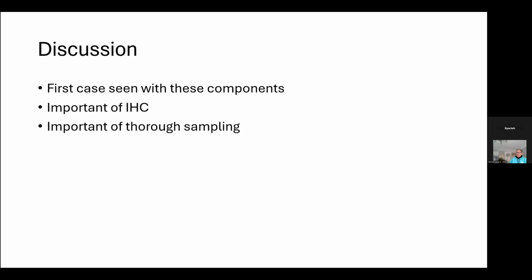the block, and then the date, and it was actually CD45 positive. And they also did the other markers, and it didn't show anything relating to lymphoma, but just mainly lymphoid cells. And so I just did an addendum report and told him that the suspicious area turned out to be just a lymphoid aggregate with germinal center, and there's no concern for malignancy or immature components. And that was how I concluded.